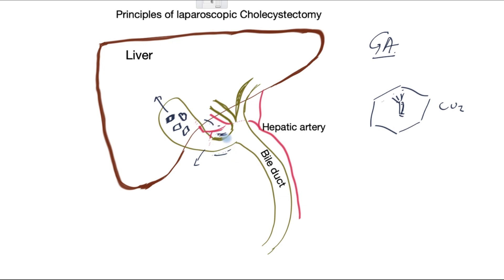Once the structures are isolated, the surgeon places clips on the cystic duct — one clip and then another further up — and two clips on the artery with one a bit further away. Scissors are then used to cut and divide these structures.